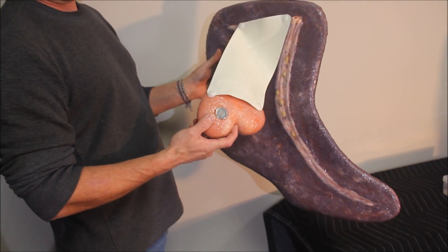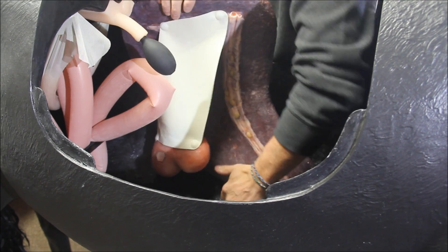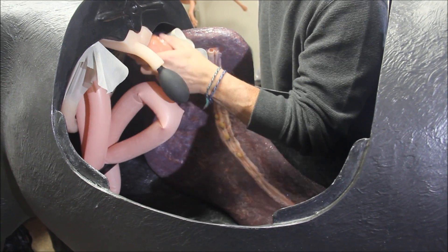A replica spleen and left kidney are attached with a representation of the renosplenic ligament. Both the kidney and spleen have magnets which connect with those situated within the horse's left body wall.